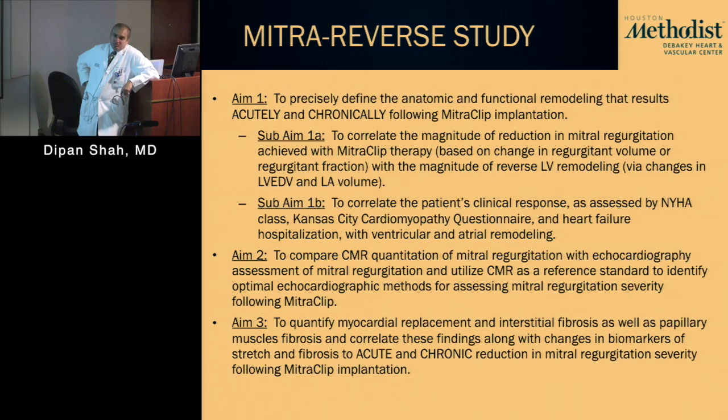So a hypothesis would be that you take a group of fresh hypertensives that have some echo findings of LVH, diastolic dysfunction, and whatnot. You get a baseline extracellular volume, and then you follow them as the blood pressure gets controlled to show regression or reduction. And I may tell you, that would be a big, big finding because hypertension is such an important disease.